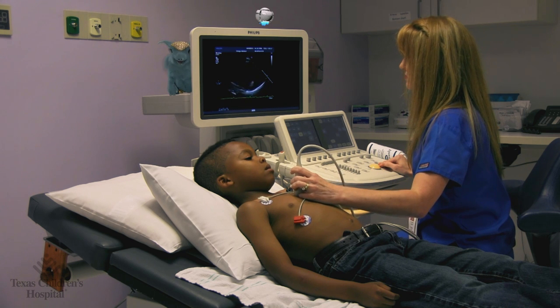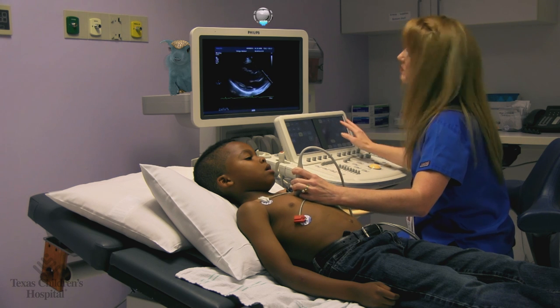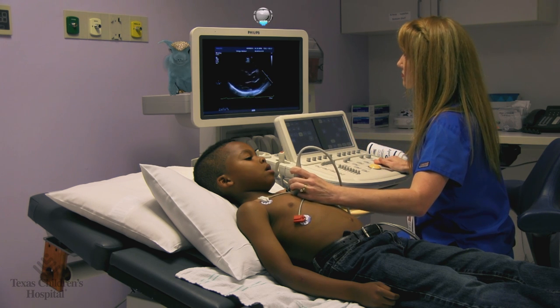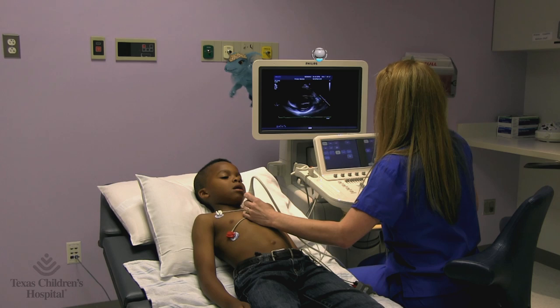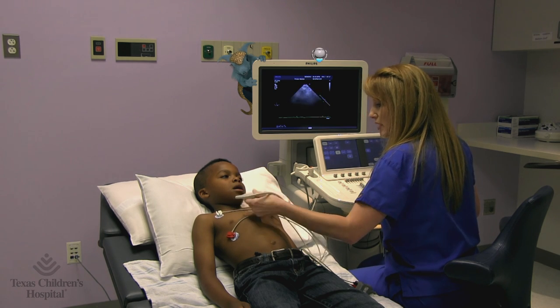Wow, look at that. That's a picture of your heart. I told you it was a cool camera. They'll take lots of measurements so they know everything about your heart, and then they'll know what to do to make it better.